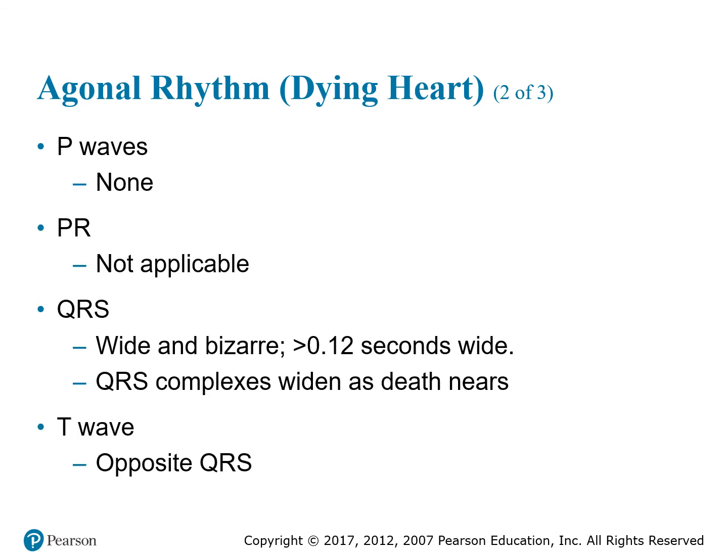And as always, your T waves will be the opposite of whatever your QRS is. So if your QRS is in the upward deflection, your T wave will be negative. And if your QRS is in the negative deflection, your T wave will be positive.